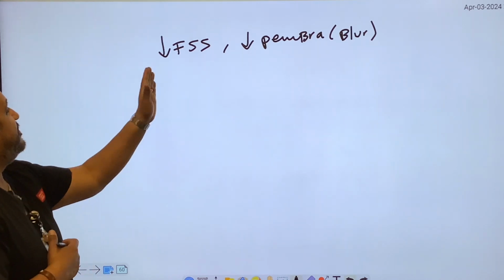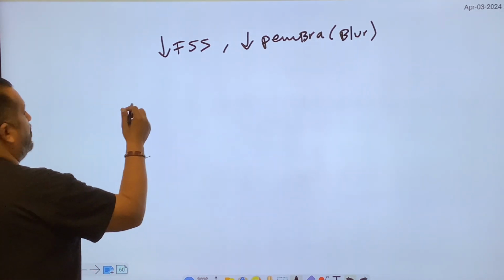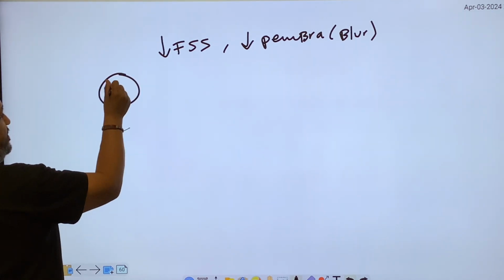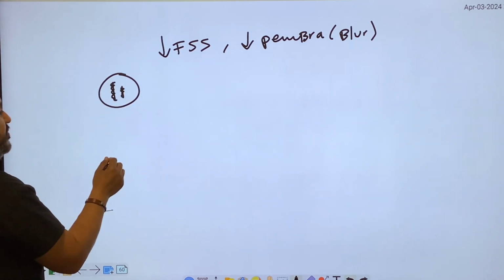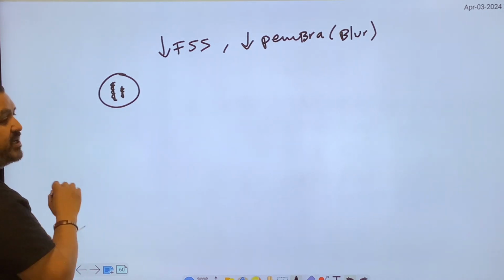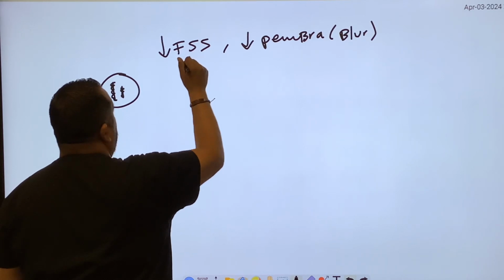So focal spot size, you have less penumbra. Let me show you exactly what's happening. Inside your cathode, you have 2 filaments, a large filament and a small filament. Remember, when you have the smaller filament, this is going to give us less penumbra, we said. And let me show you exactly how this is going to happen. I'm going to draw here.